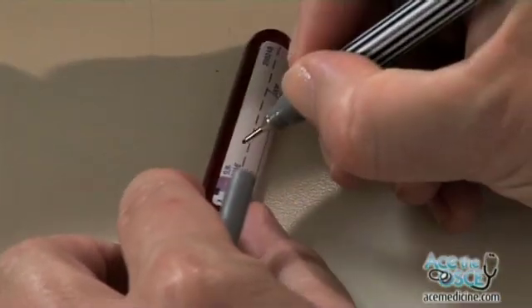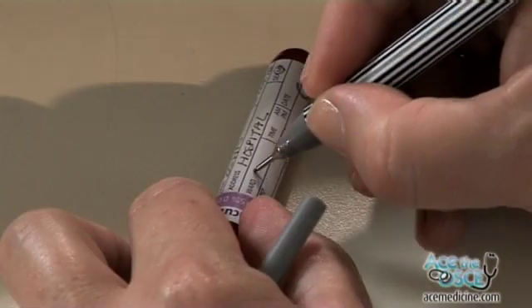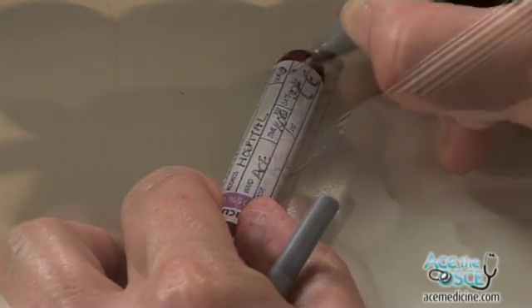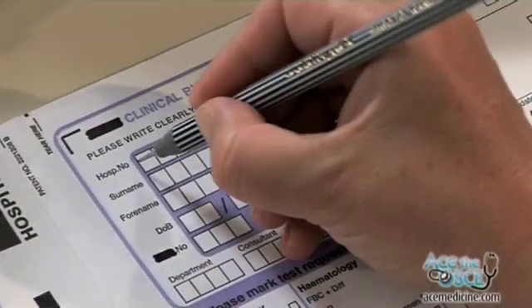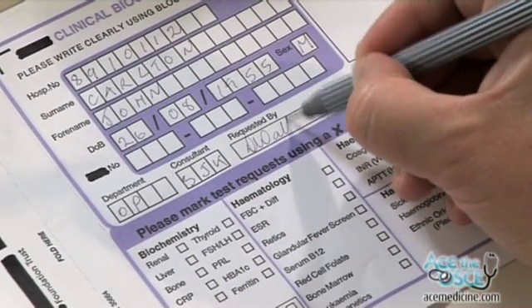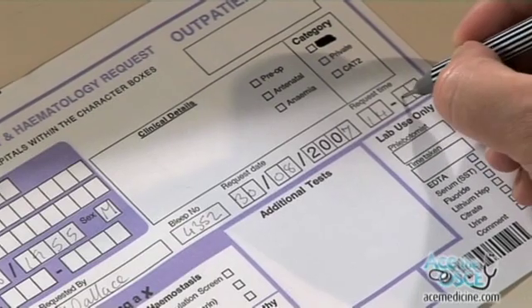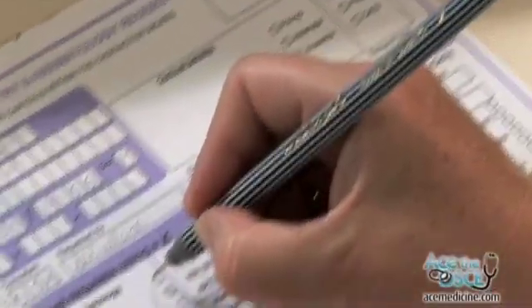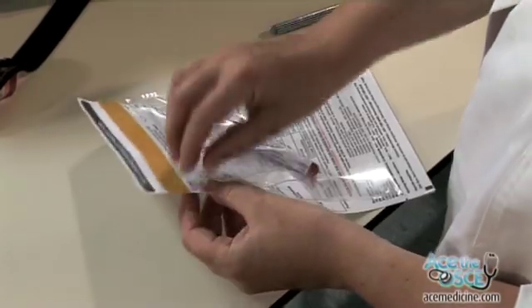Label the blood bottle. Include patient's name, date of birth, ward, time and date, hospital number, and your signature. Label the blood form as appropriate. Seal the bottle in the blood form.